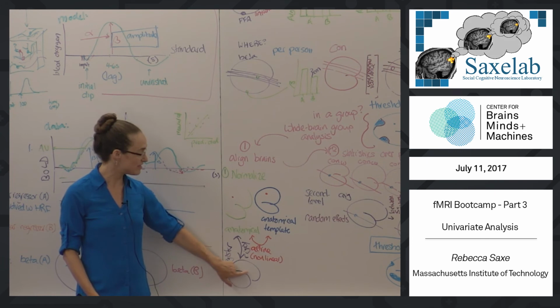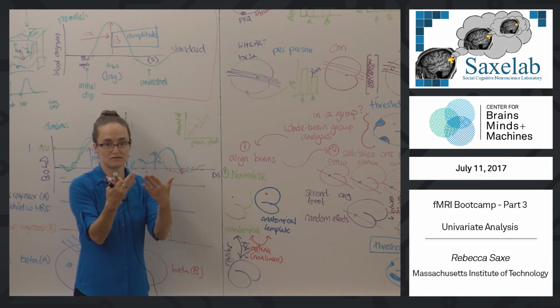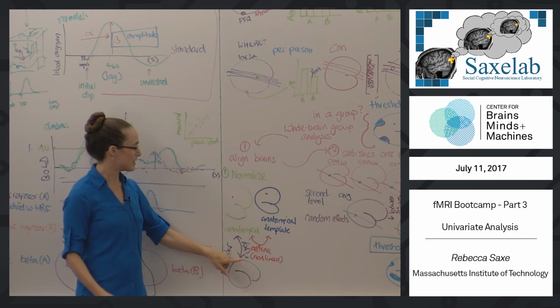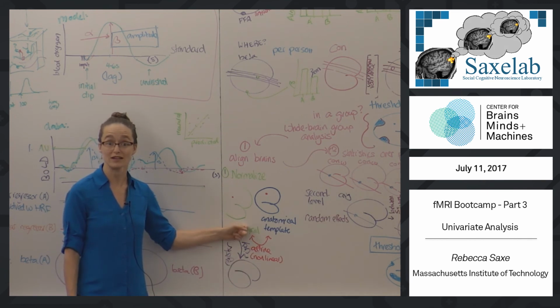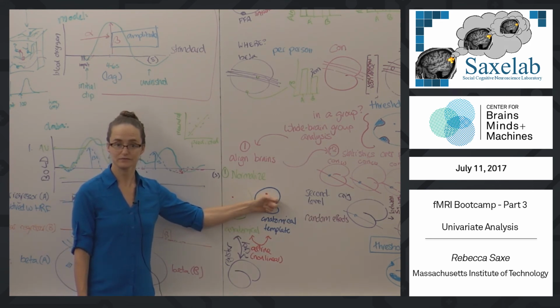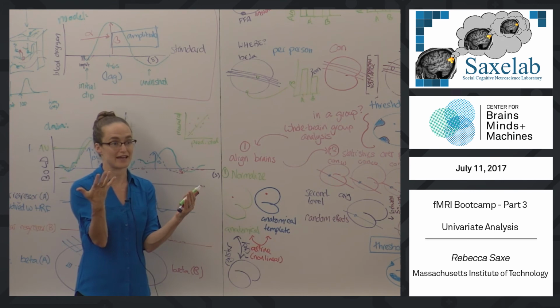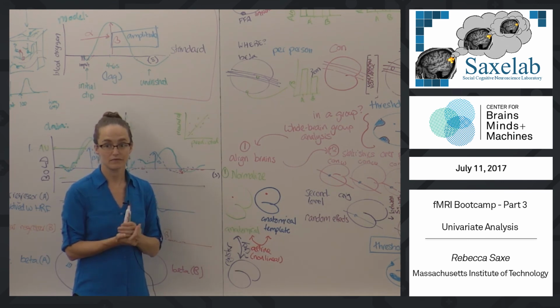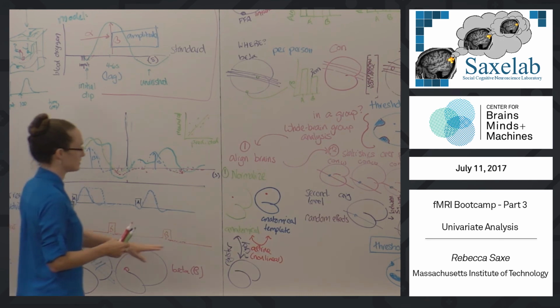And so it's very hard on these data to get the brains aligned really well. If you take two functional images, the data are so bad that your alignment will be very bad. But if you align the functional to the anatomical with a rigid rotation, you can get that pretty right by knowing the constraint that the brain is not allowed to change shape. And then you can get this one right by having a very high quality image. Two-step registration and normalization is the best way, using just what the image looks like, to get the brains aligned across subjects. So that's one way to do normalizing and aligning, is to use just the images, the pixel values, in order to create the alignment. And again, we usually do that in these two steps.